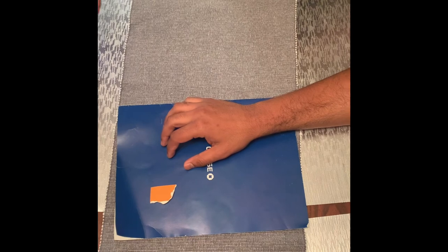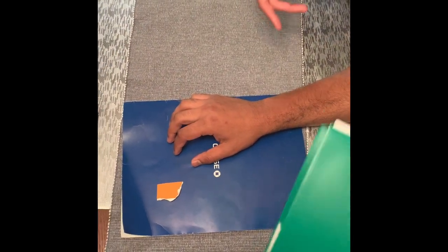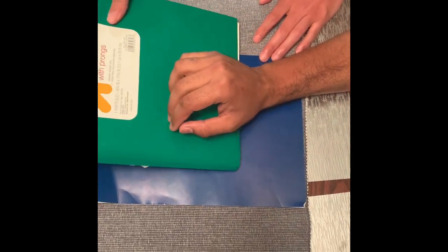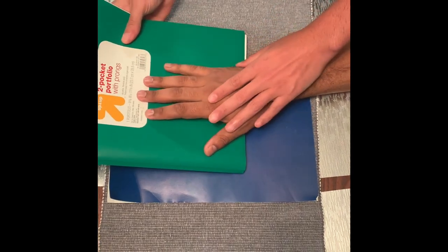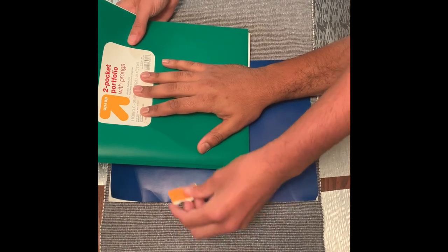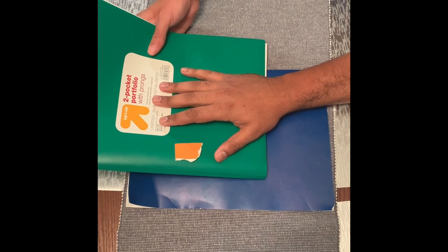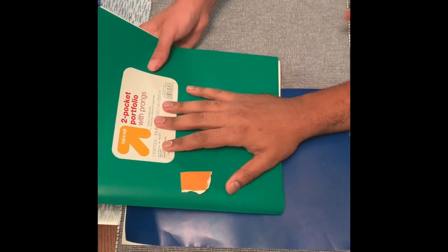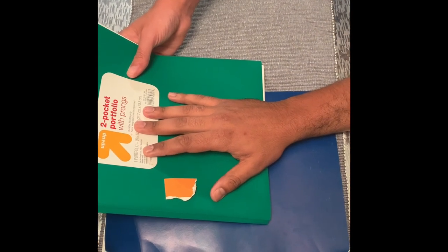Now the next view is going to be the wrist Stecher method for the scaphoid. We are going to need a device to place the hand at 20 degrees. The central ray is going to be directed at the scaphoid. Don't move — click.